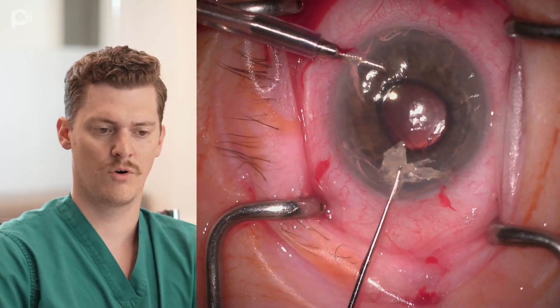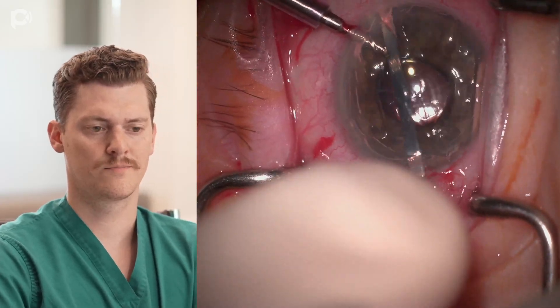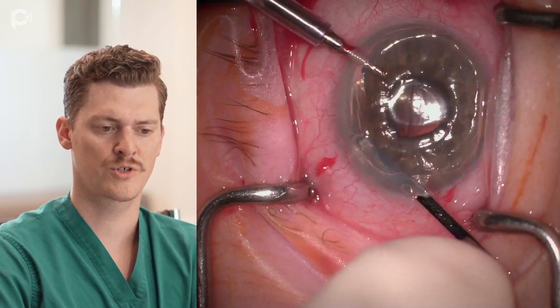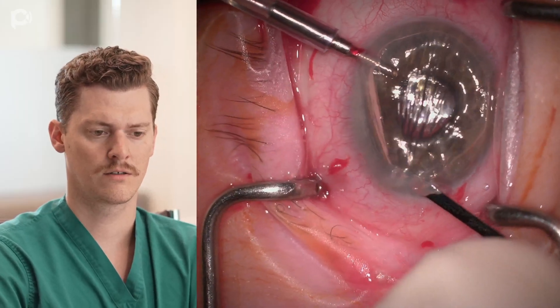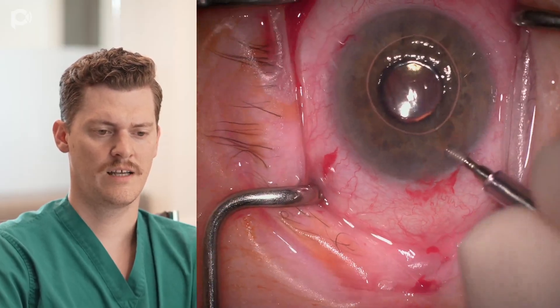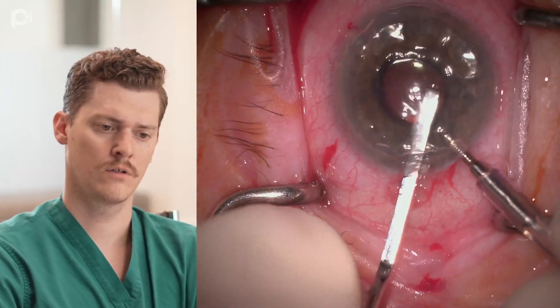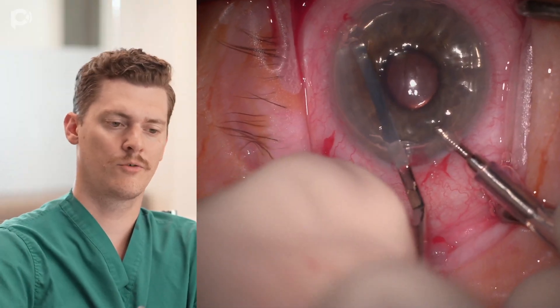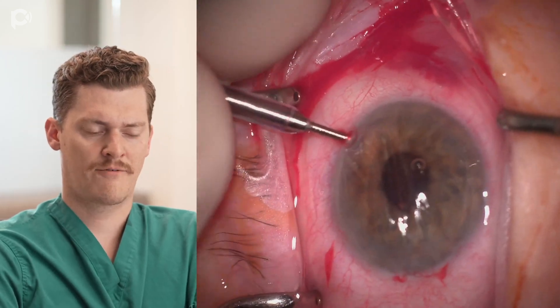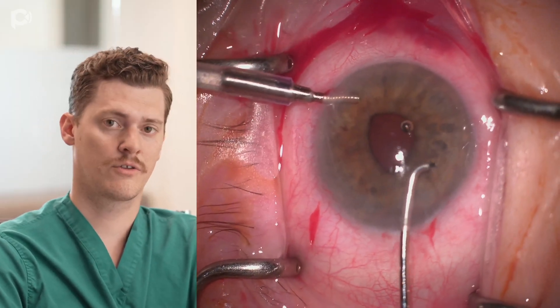Grabbing it from the edges, wadding it up into a ball, and then pulling it out through the main wound. Out in the periphery there are still some residual fragments, so I'm going in with the Mallis scraper here and removing those peripheral fragments so that I have more space to work with during graft unfolding. I'm moving the AC maintainer from across the eye over to proximal, and moving the Mallis scraper over towards where the AC maintainer was to remove those residual fragments — because when the AC maintainer is in place, sometimes it's difficult to get those fragments out. After I'm satisfied with the Descemet's membrane removal and no residual fragments, I go in to make a PI using a thermocautery device.